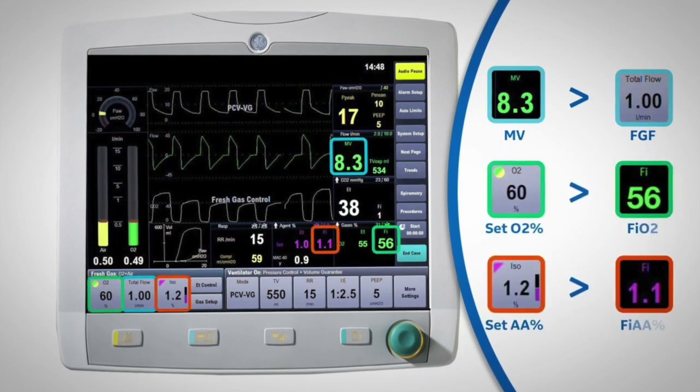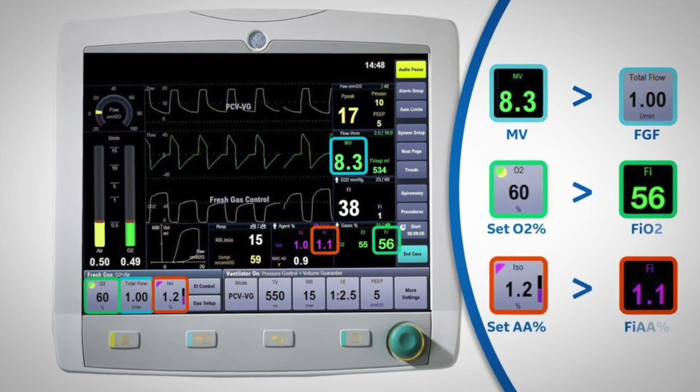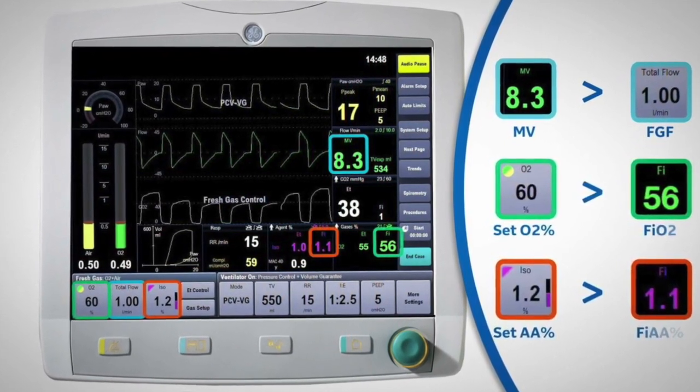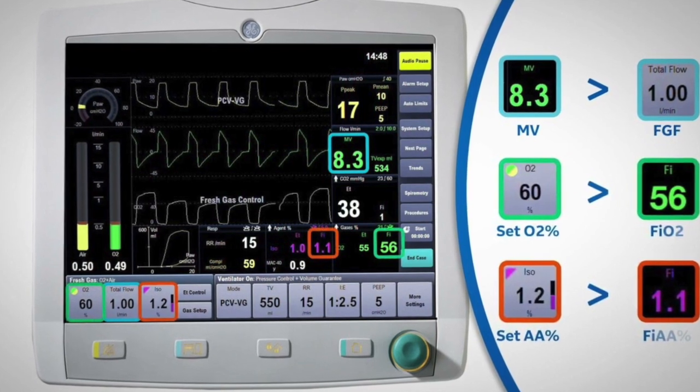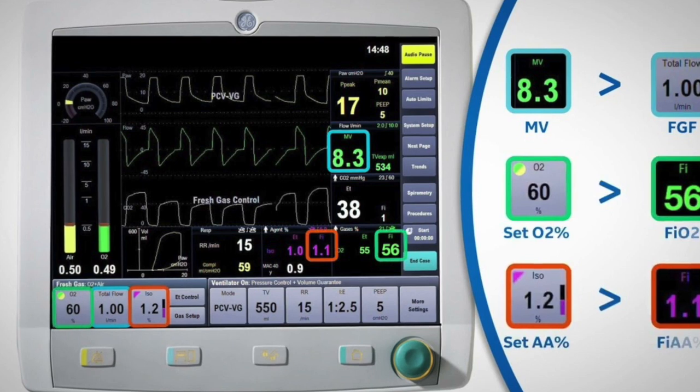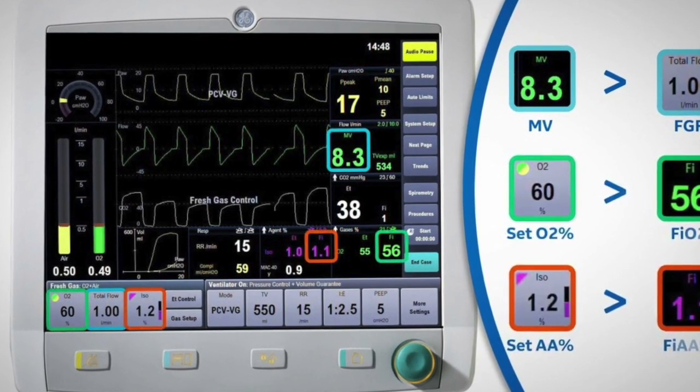Also, it's imperative to perform meticulous pre-oxygenation by observing the end-tidal O2 level on the bottom right hand of the screen. These seemingly small alterations to your anesthetic plan will make large differences in your care for this population.